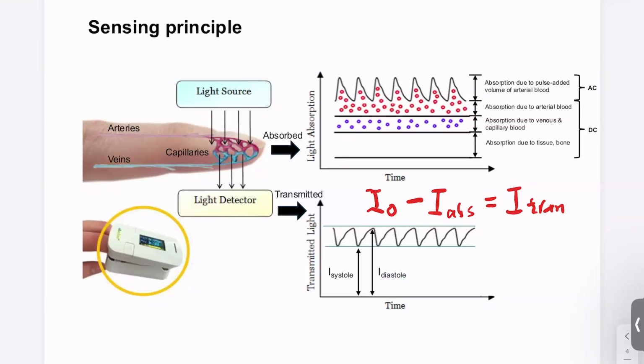These two parameters are very important when we do SpO2 calculation. Just want to bring them out first. So what information can we get when we look at these two plots? They are essentially the same plot, so for convenience, let me just look at absorbance.